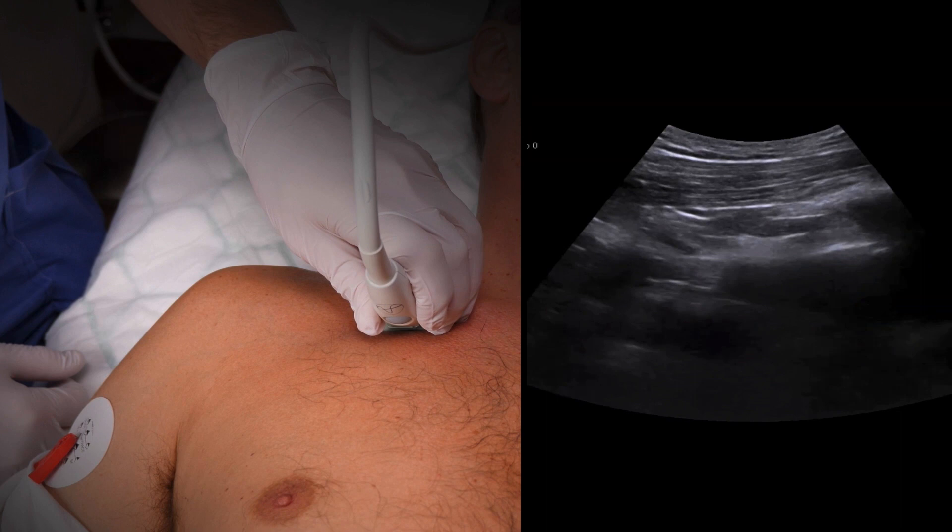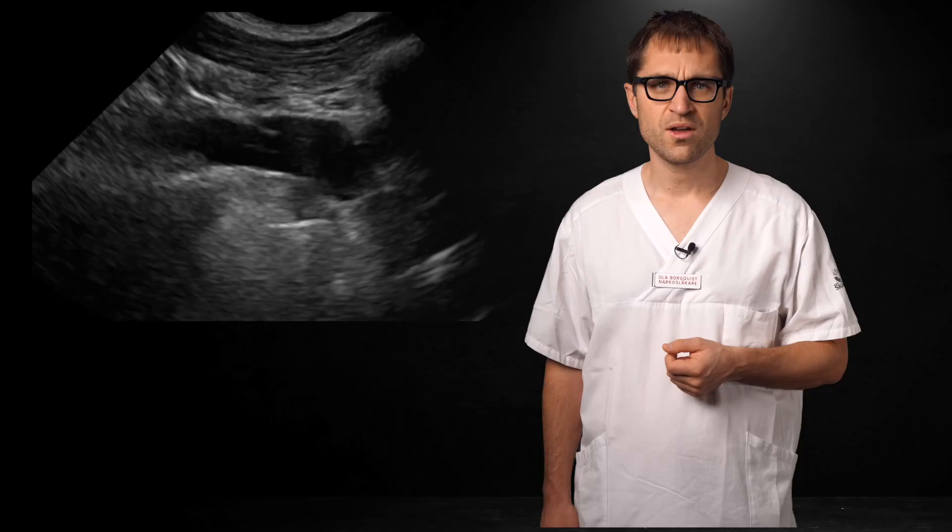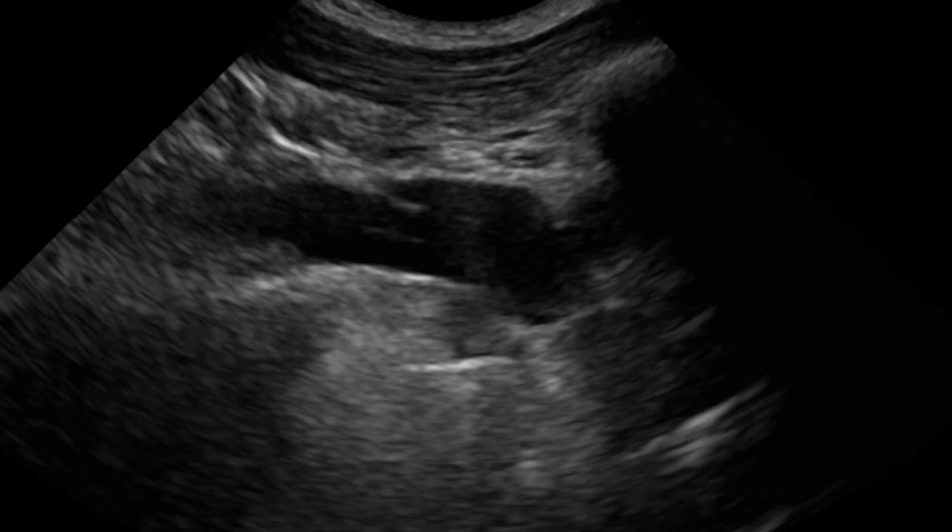Note how the pulsation of the artery is transmitted through the tissue, making the vein appear to be pulsating. Here's another example: a shallower vein with the added bonus of visible valves, and a deeper, prominent, pulsating artery.